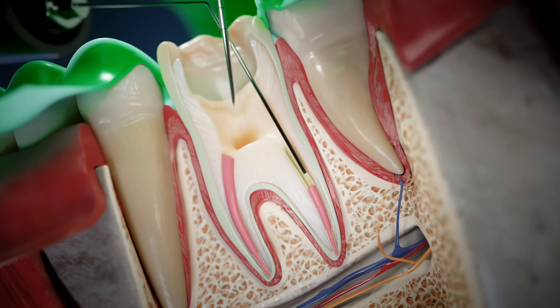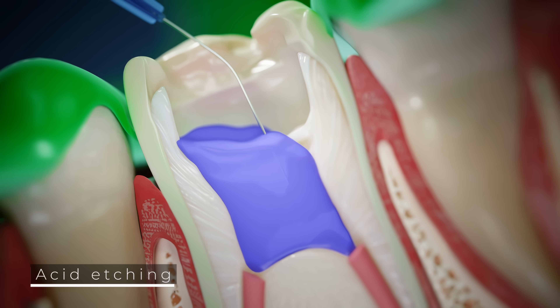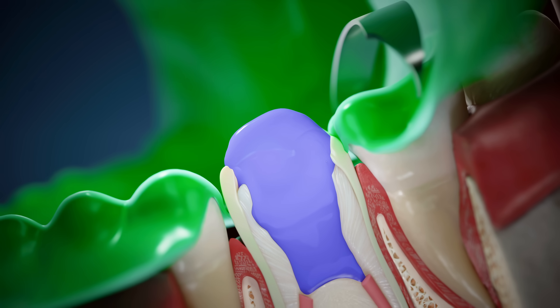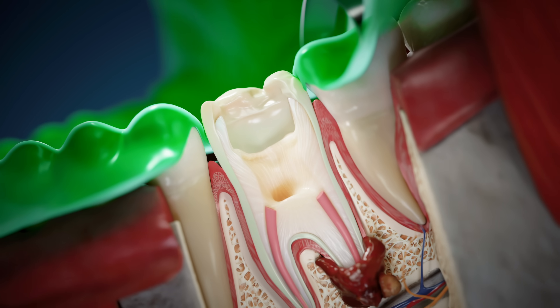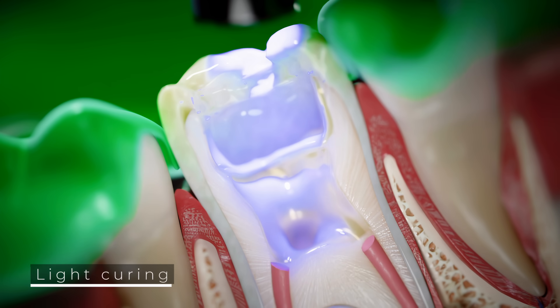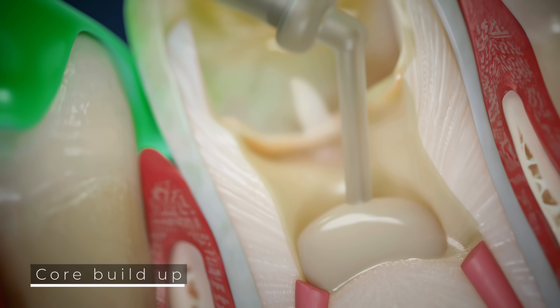Adhesive preparation is performed to ensure proper bonding of the restorative material. The enamel and dentin are etched with phosphoric acid, followed by application of an adhesive and subsequent polymerization. The tooth is restored using a light-cured composite material.